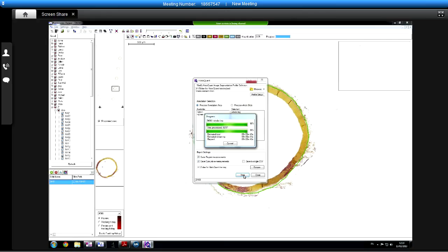I'm wondering whether this slowness here might well have been helped by your idea of eliminating the middle.